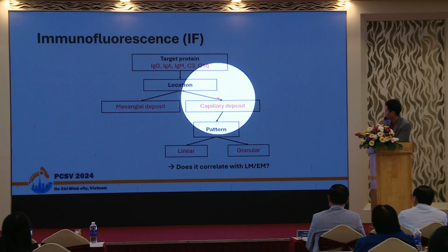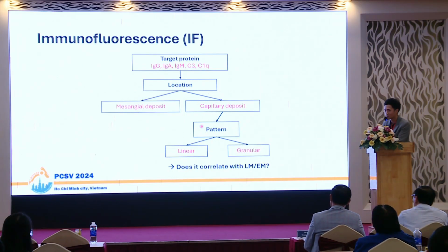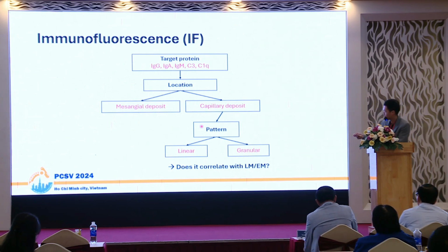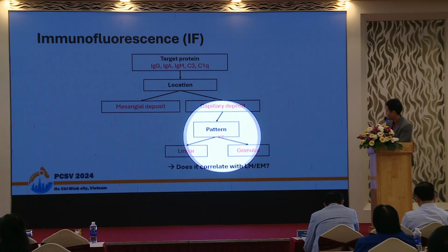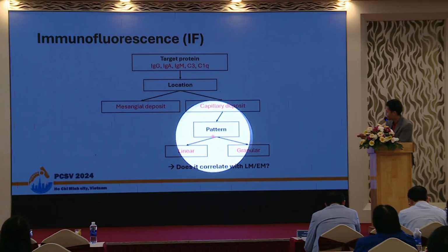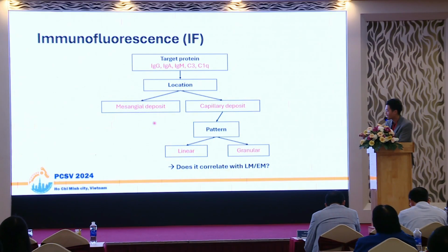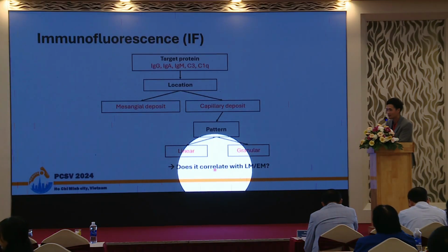If it is positive in the capillary, depending on the size of the positive signal, we determine if it is a linear pattern or granular pattern. And the most important thing is we have to correlate our IF interpretation with the LM or EM or clinical findings.